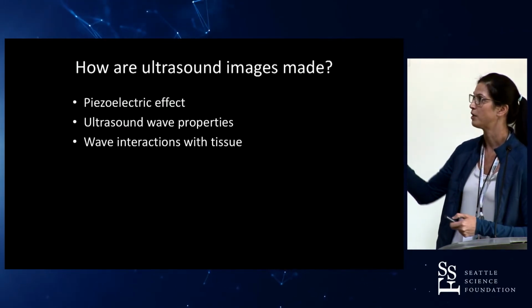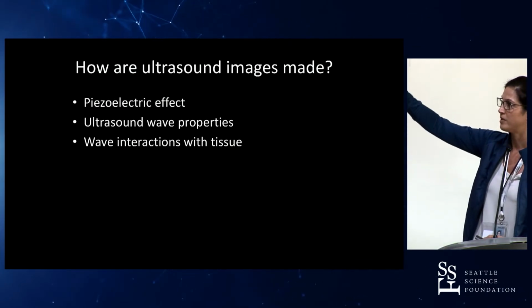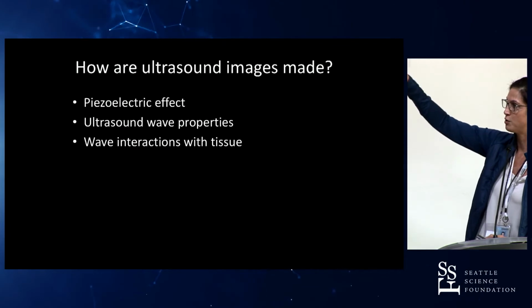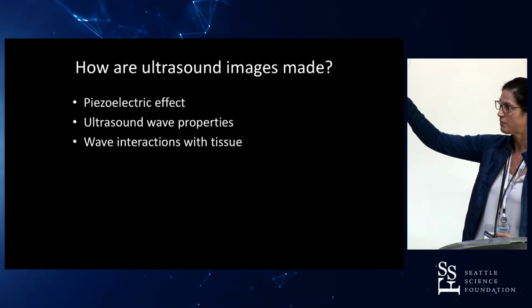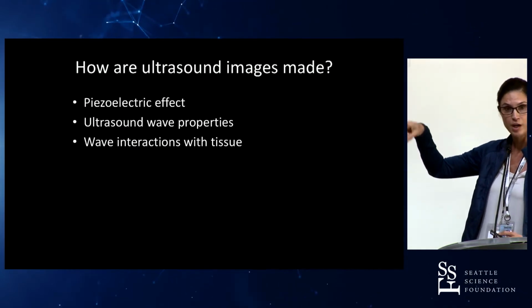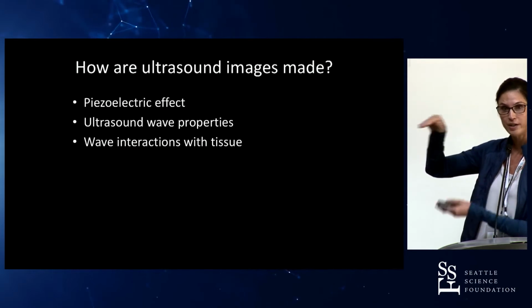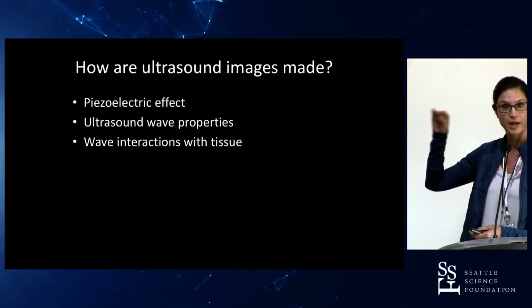If you look at this image, you can see the probe. The standard orientation is the transducer on the top of the image, shooting down. The waves that propagate through fluid, which is going to be black, do not get reflected back. So that area, for the time required, will map to nothing, so it's black.